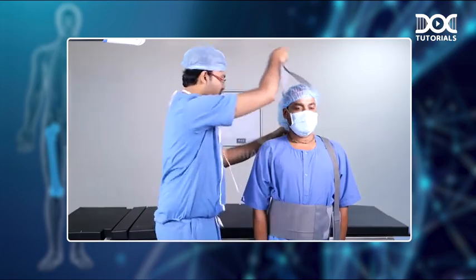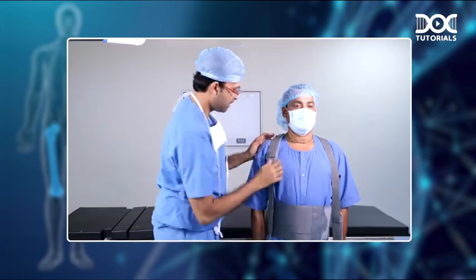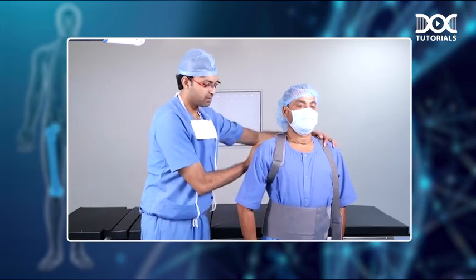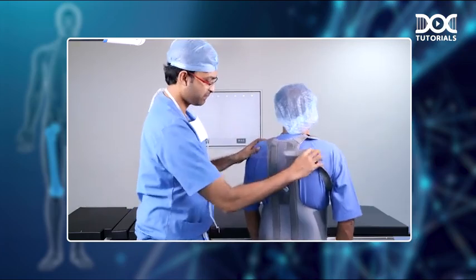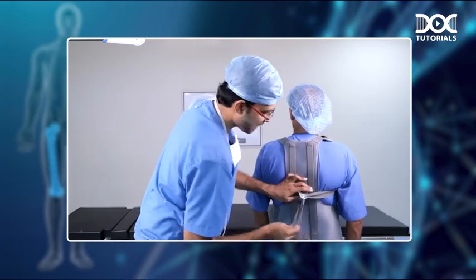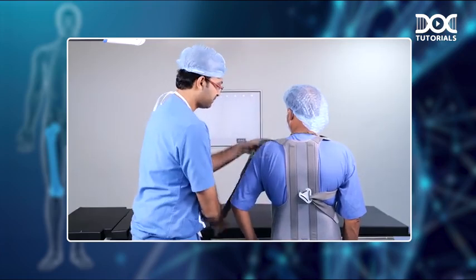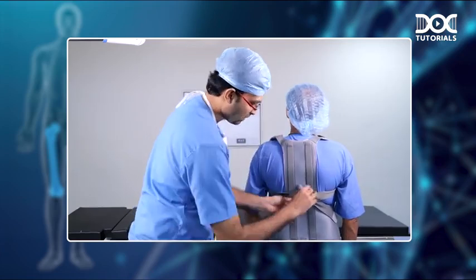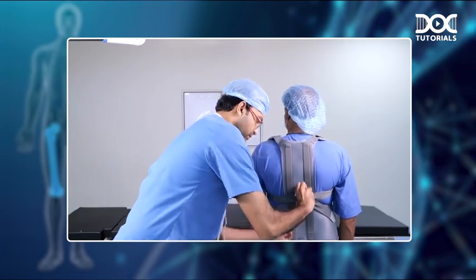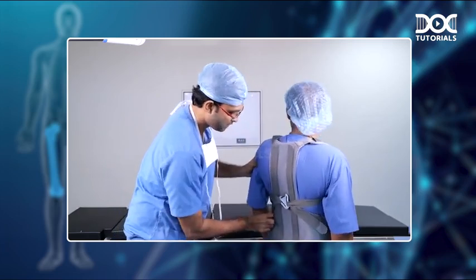Next step is what is important. You have two straps like this that go around the shoulders. So you have to wind it around the shoulder like this. Take it behind. Can you turn? And you have a device like this. You have to put it through it and stick it on the side. Same on the other side. You hook it inside this. Then you tighten it and you stick it on the side.